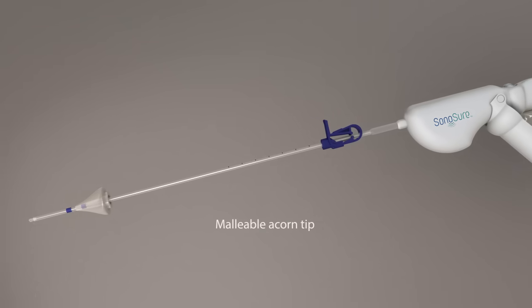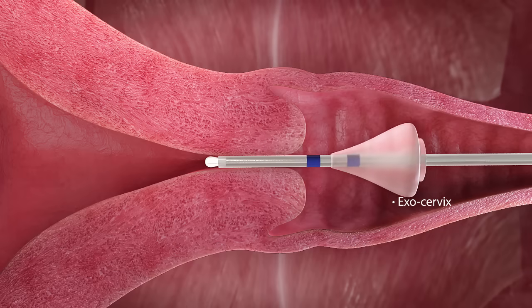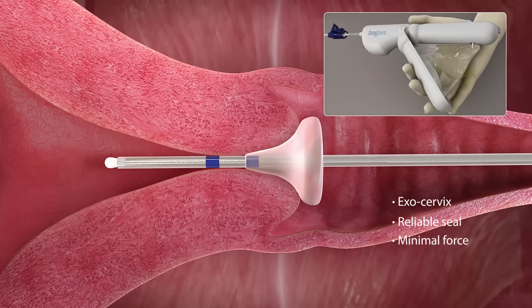Sonosure's malleable acorn tip easily conforms to the shape of the exocervix, regardless of size or shape, and creates a reliable seal with minimal force.